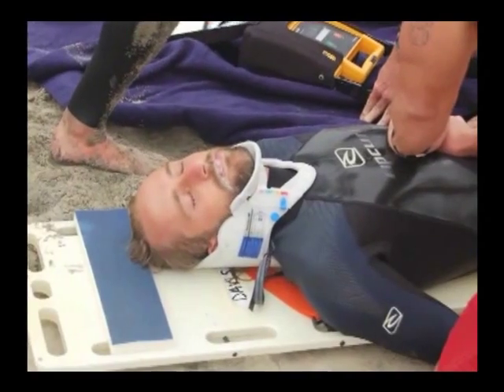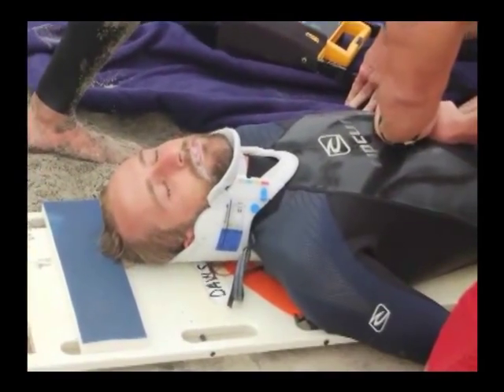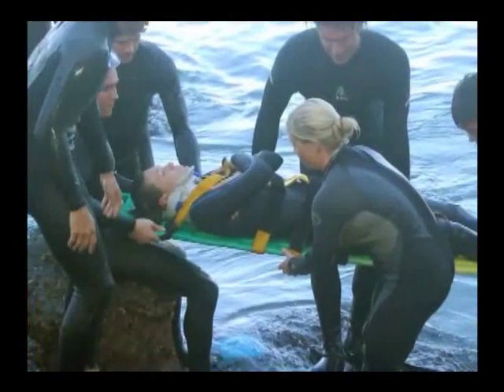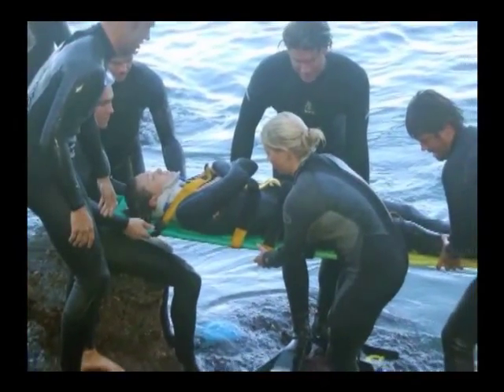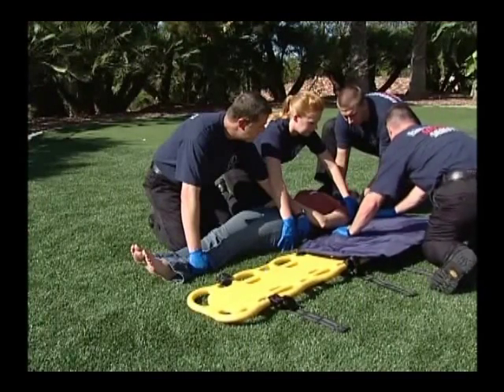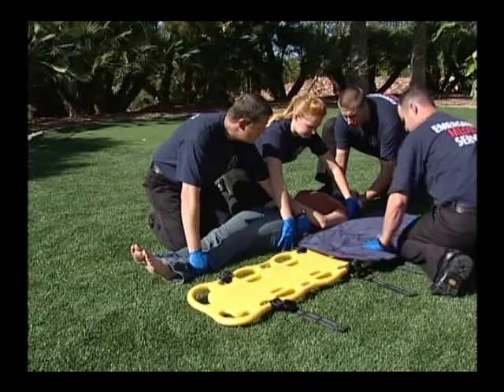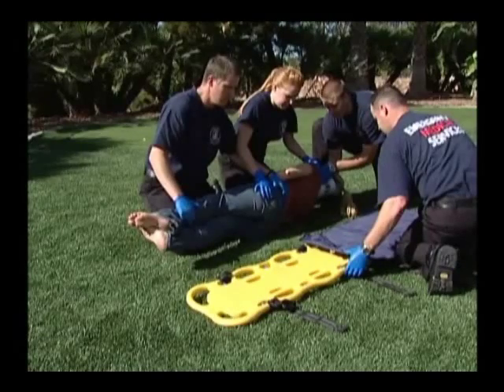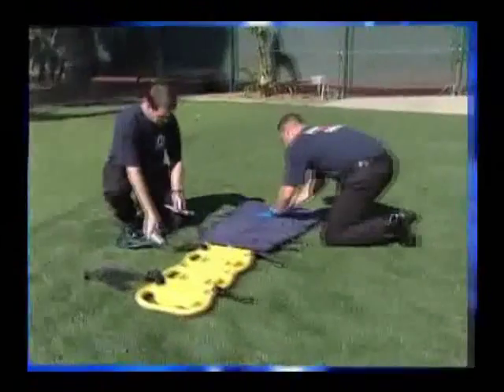We all know that a flat backboard is simply not comfortable. And for many patients, especially the elderly and those with chronic back problems, a backboard can seem like a torture rack. The evacu-splint makes an excellent padding device for a backboard. The large-size evacu-splint pads the area from head to the hips on most adult patients.